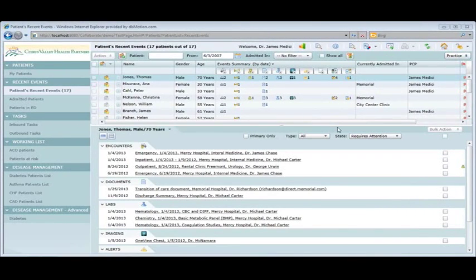So I can now see this across the enterprise for all my patients. And we'll talk about the workflow of this a little bit more in a second, and how in the future we're moving more of this information to the agent as well. Clearly, there's a whole piece here for practices that are still on paper, which I won't address right now unless people have questions about this.